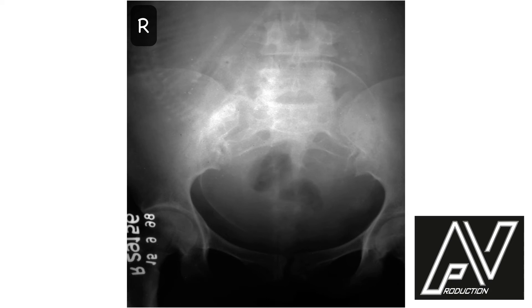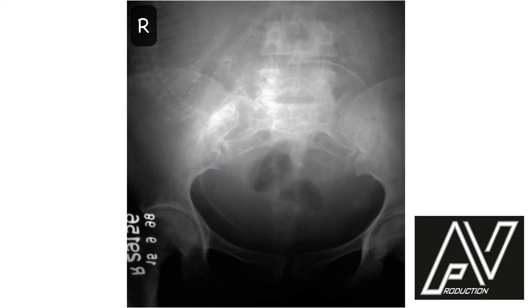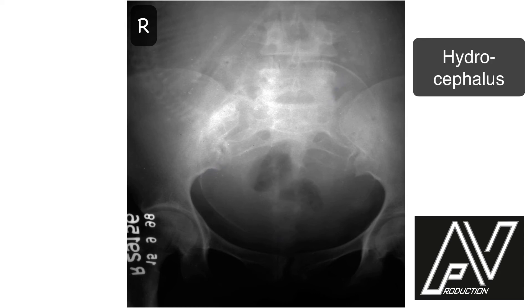This is a plain x-ray of the abdomen and pelvis, AP view, well centralized, well exposed, showing a single fetus in longitudinal lie, cephalic presentation. The head appears very big in comparison to the fetal size and the pelvis. The bones of the skull vault are separated to a great extent. Therefore, my diagnosis is obstetric x-ray showing a single fetus with hydrocephalus.